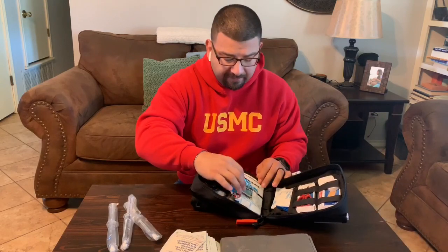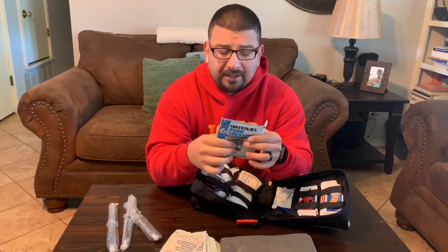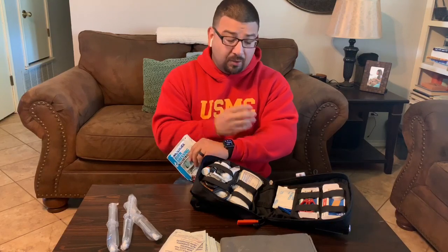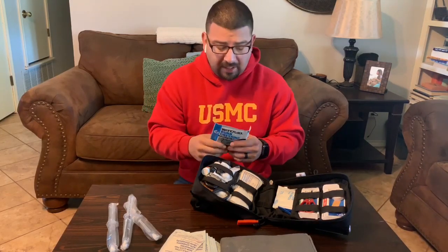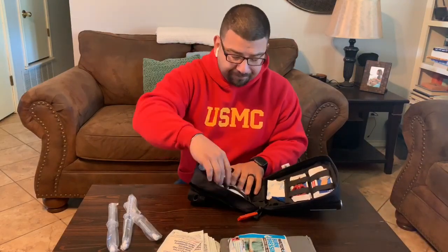The next thing I have is this burn dressing. It says water gel. I don't remember the exact name of the gel that's on it, but obviously you want to be very careful with what you put on a burn. If you put something dry on there, a shirt, stuff like that, when you go to pull it off, the skin, the blood, everything starts to adhere to that, and you end up ripping all of that off. So you want to be really careful what you put on a burn. That's why I have this right here. I have not had to use one of these yet, but it is always good to have.